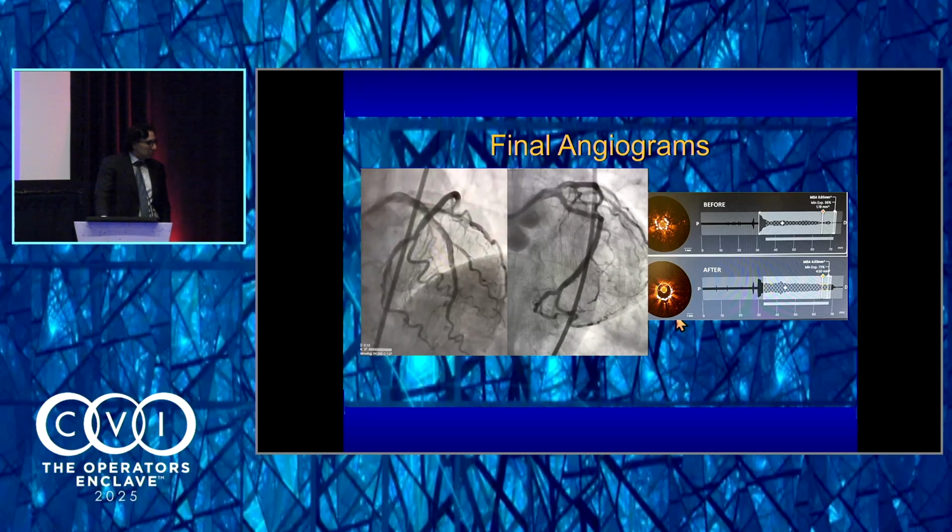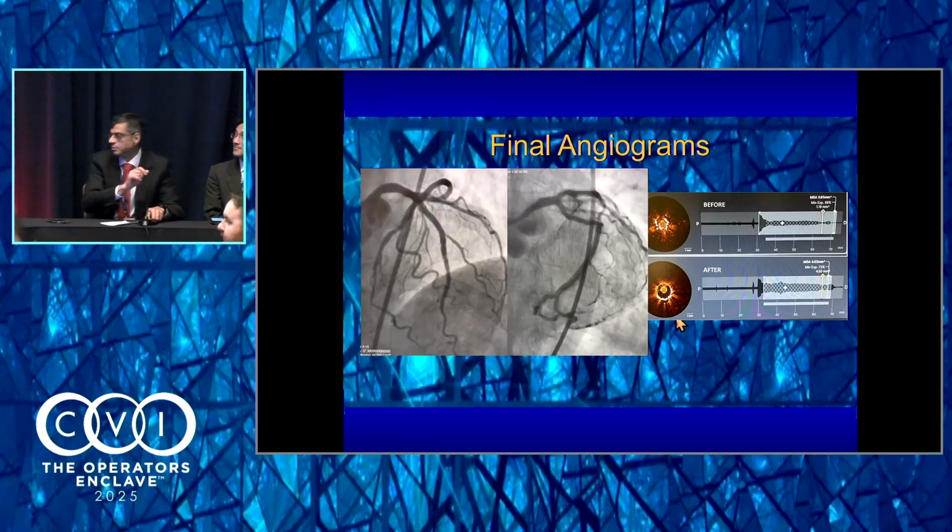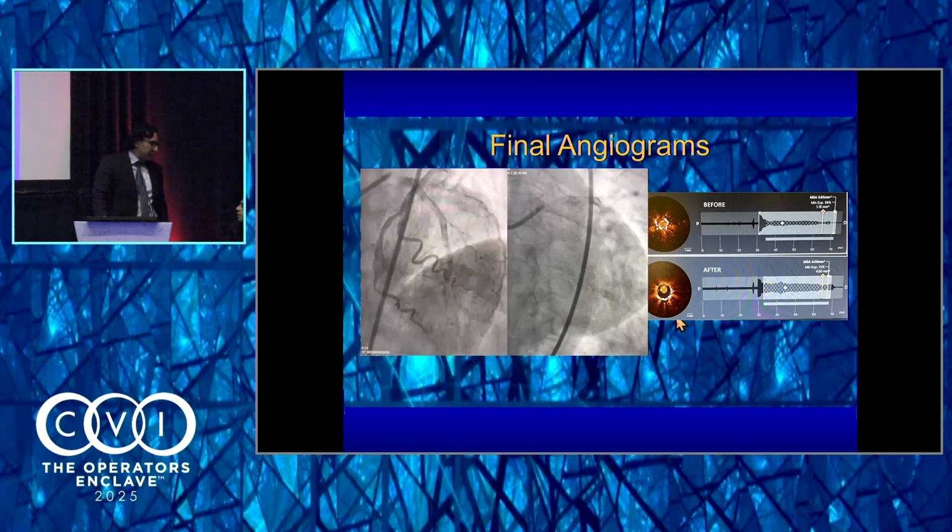Did you downsize the size of the balloon? That's what people say, right? What was the size of the OPN that you used? So I used a 3.